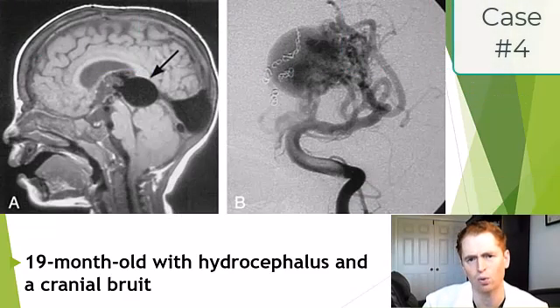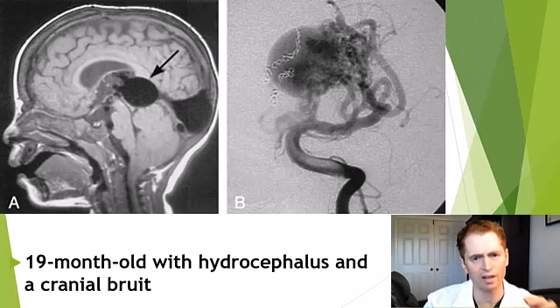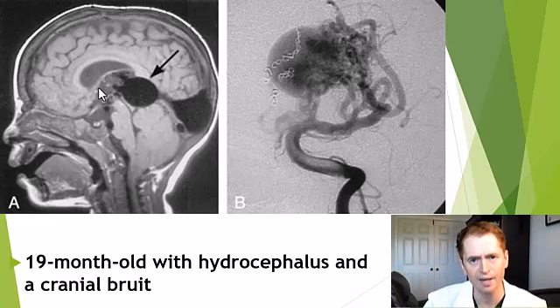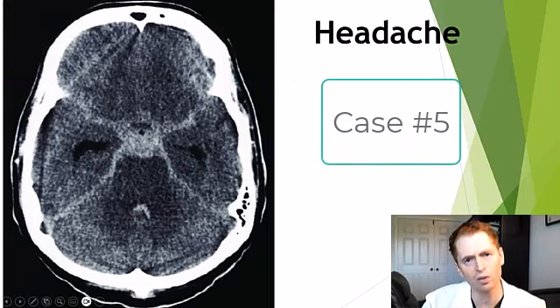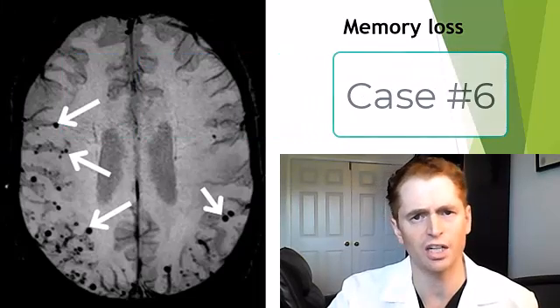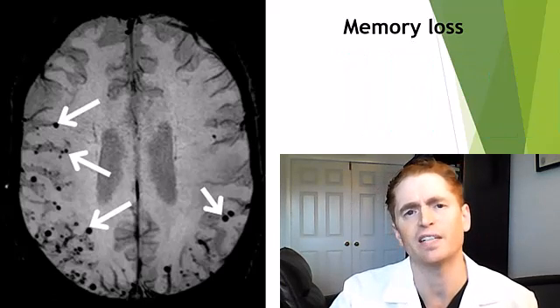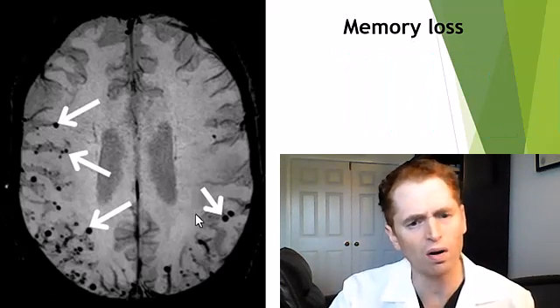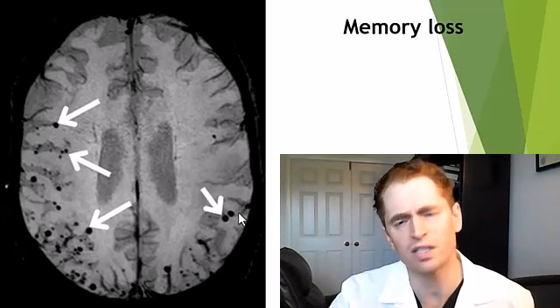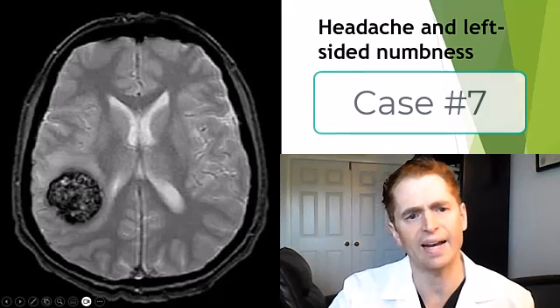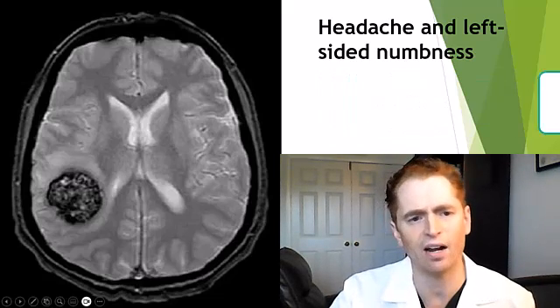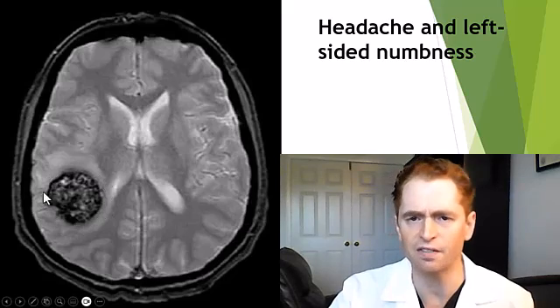This next one is a 19-month-old with hydrocephalus and a cranial bruit — placing a stethoscope on the back of the scalp reveals an abnormal sound. On the left is the sagittal MRI and on the right you can see a catheter angiogram. For this one, the only clue I'll give you is headache. This is a SWAN sequence MRI of someone with memory loss — gradient echo or GRE would show similar findings. What are these low-intensity dark circles and what is the diagnosis? This individual has headache and left-sided numbness on a gradient echo sequence — what is this very distinctive lesion?